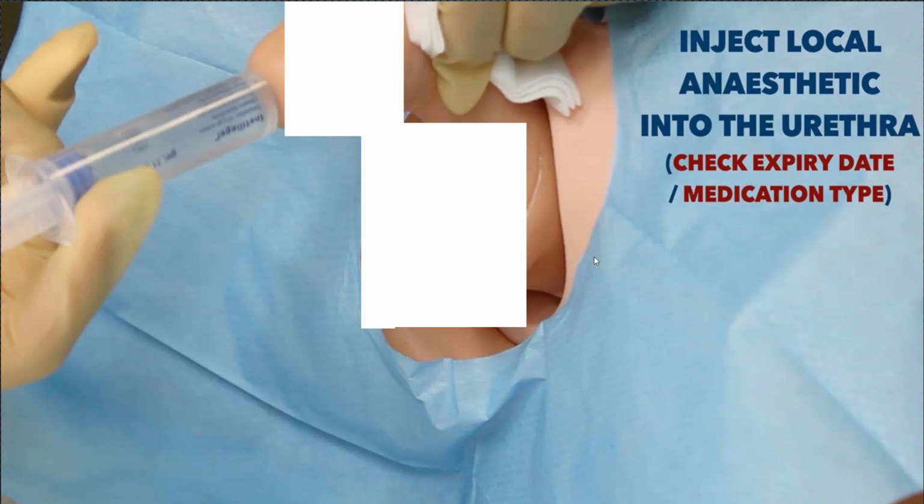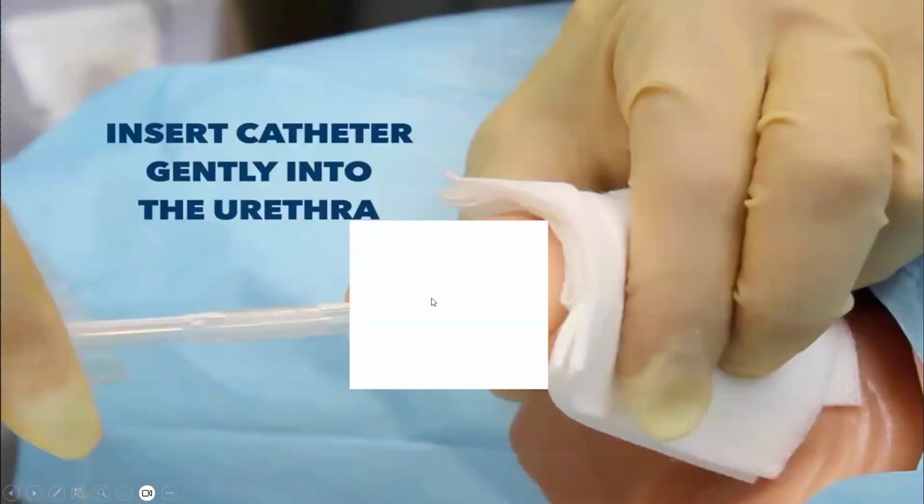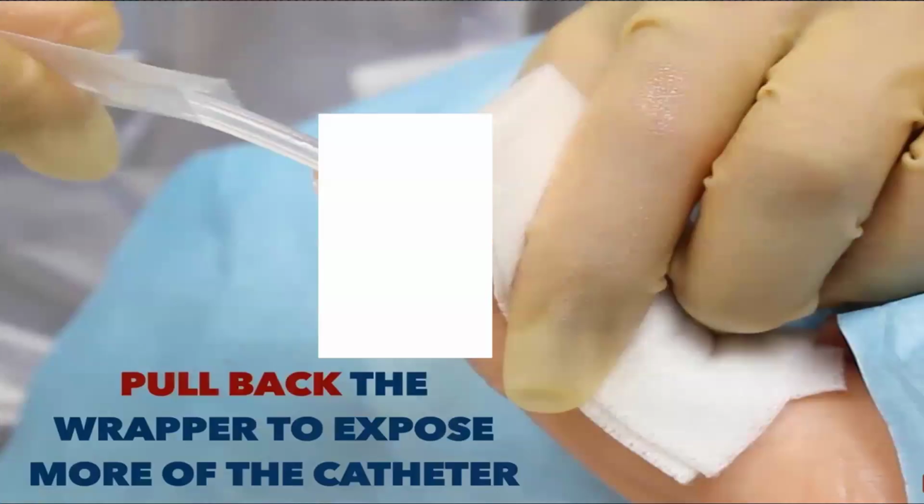Then regarding the catheter, you will open the catheter wrapper, ensuring not to touch the catheter. You will hold from the plastic part, so don't touch the catheter itself. Hold the penis with the non-dominant hand and insert the catheter with the dominant hand until you reach fully.